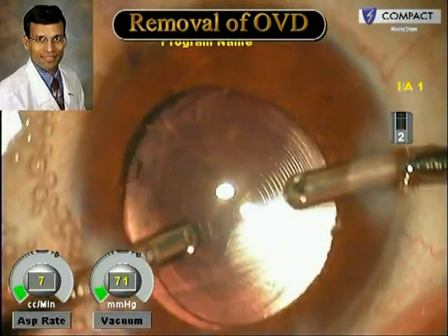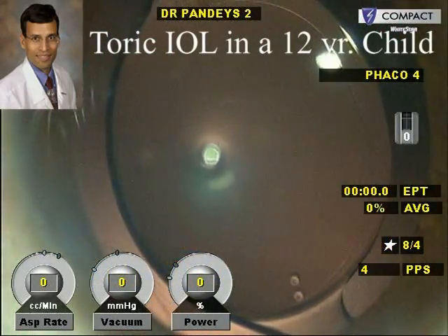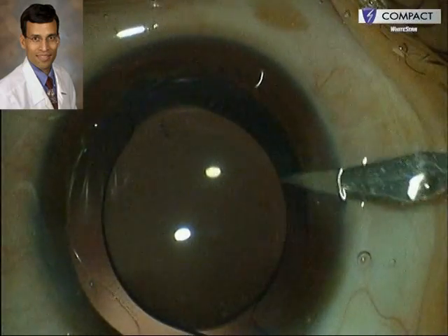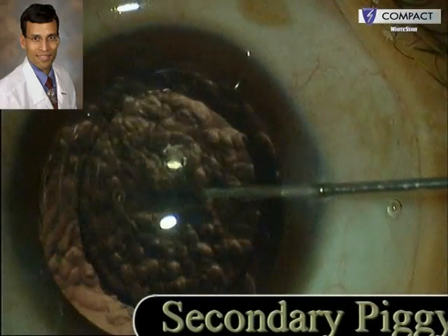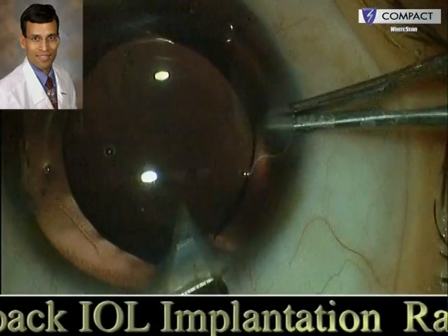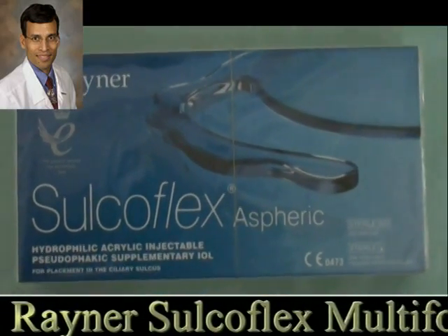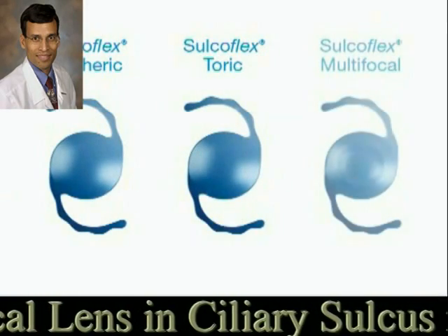We then remove the viscoelastic from between the IOLs. Secondary piggyback IOL implantation is a very useful technique for managing cases of refractive surprises after cataract surgery. This is a case where a primary IOL implantation has been done; the first IOL is very well centered within the capsular bag, which is a prerequisite for attempting any secondary piggyback IOL implantation. The corneal endothelium is coated with a dispersive viscoelastic device, and a Rayner Sulcoflex IOL is being used here. The Sulcoflex Rayner hydrophilic acrylic lens has been devised for implantation into the ciliary sulcus in a piggyback manner for managing refractive surprises.